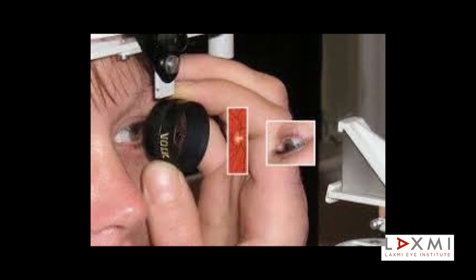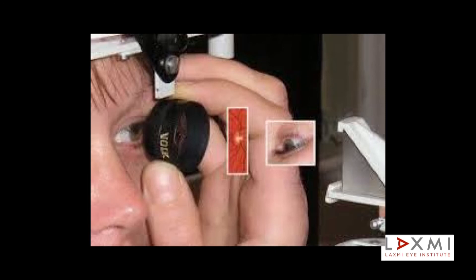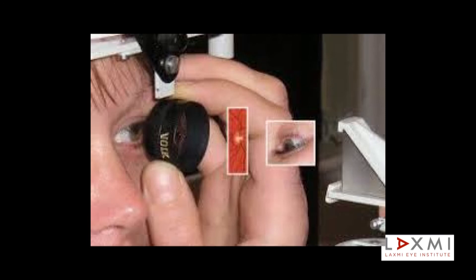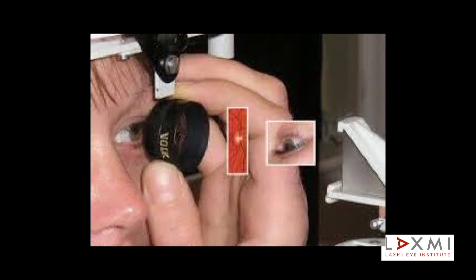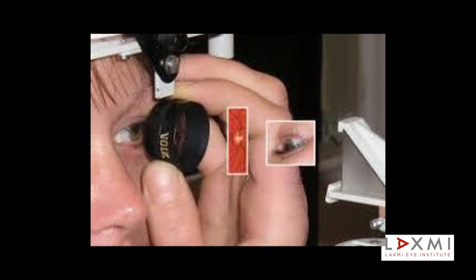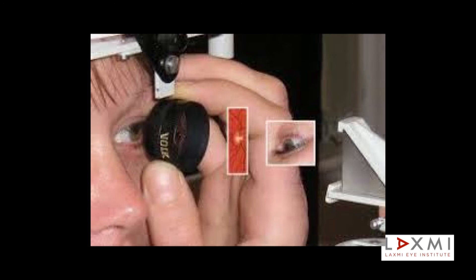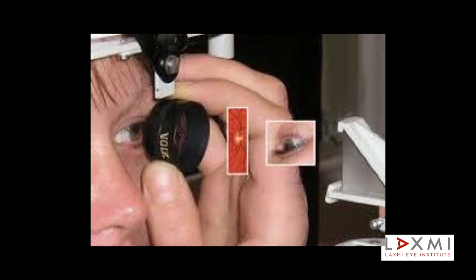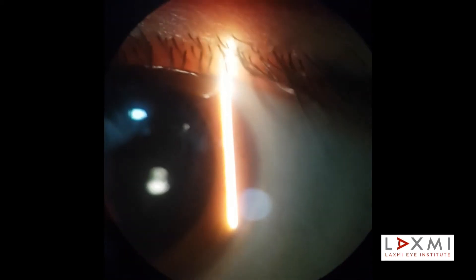Due to the strong converging power of these lenses, the image formed is actually minified, but the magnification of the slit lamp microscope allows the observer to see a magnified image. Starting with a 90 diopter lens.